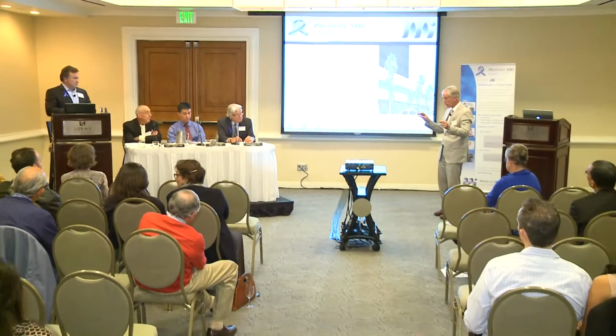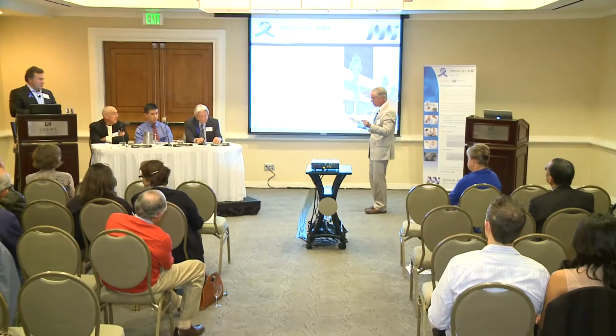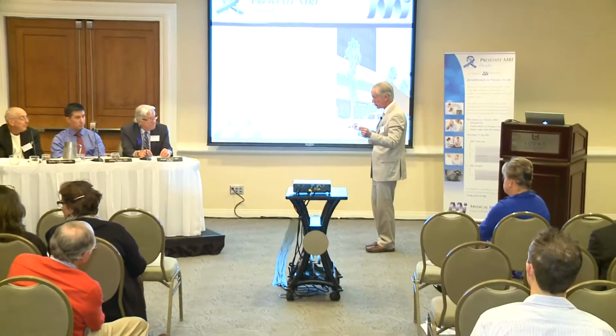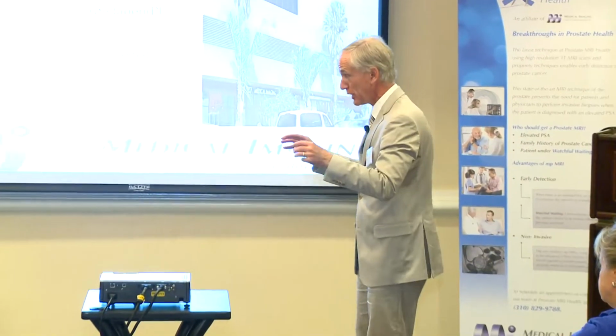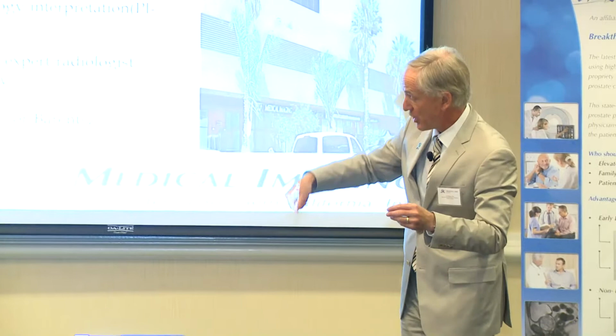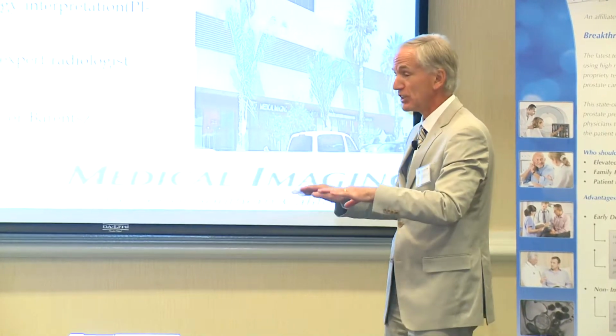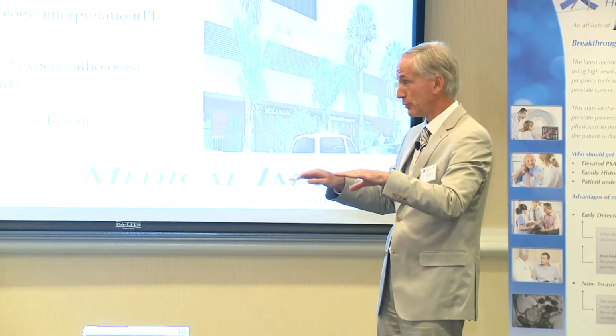And the American College of Radiology will have the minimal requirements for prostate MR. If you don't fulfill the requirements, you have a problem. You may not even be reimbursed by the healthcare providers. That's what's going to happen. Yeah. We even had a discussion about diffusion-weighted imaging. There is a certain machine which is not as good at diffusion-weighted imaging as others. And within the American College of Radiology PI-RADS Committee, we had a discussion. Should we lower our minimal requirements? We said no. We have baseline minimal requirements for prostate MR.